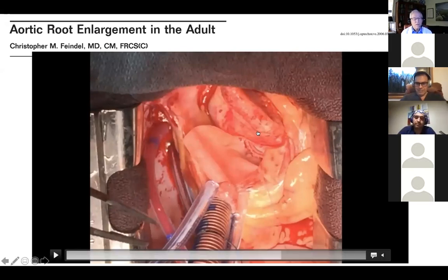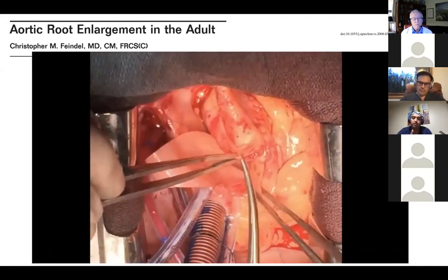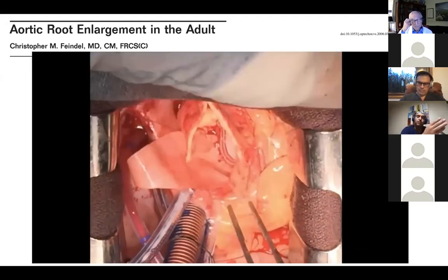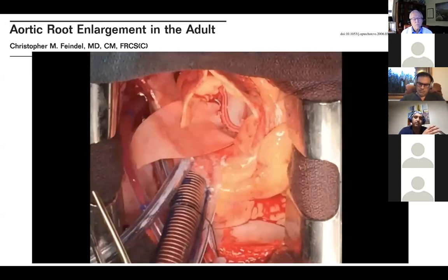And I think one important part is that usually most surgeons will place a patch here, and the most common mistake is to use it in that direction. But this part that you are going to do here is really critical, because if you extend the incision toward the aortic annulus, I think the final result is much better.